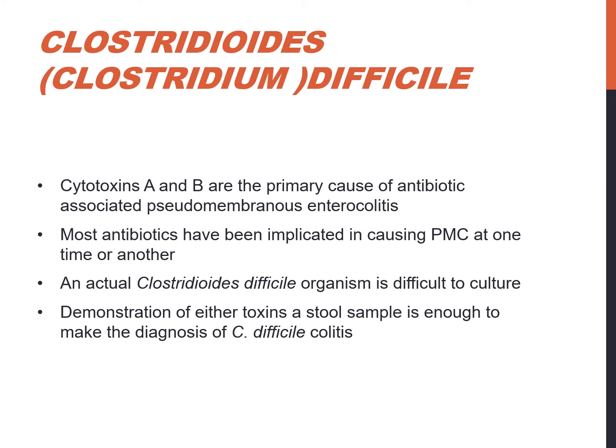An actual Clostridioides difficile organism can be difficult to grow, but it's not impossible to grow. You can actually grow it on CCFA media, which we'll talk more about when we get to anaerobes.